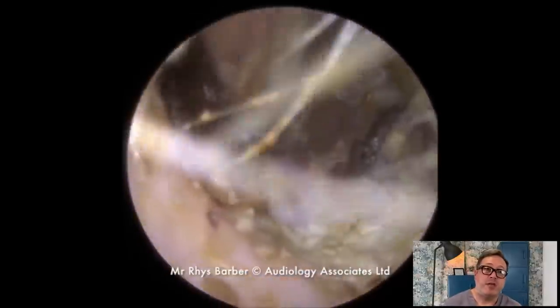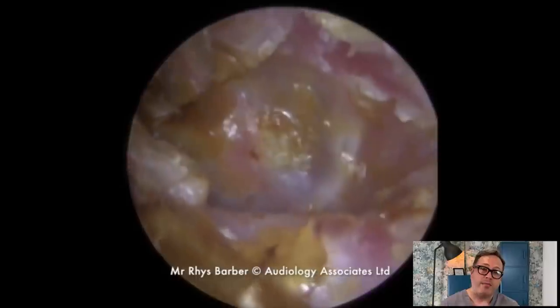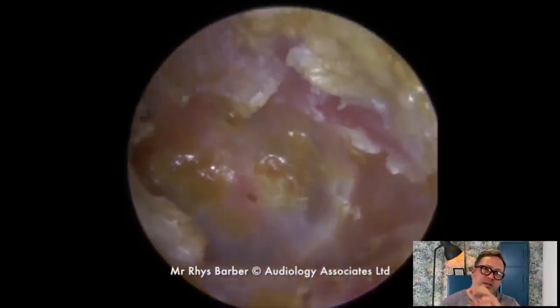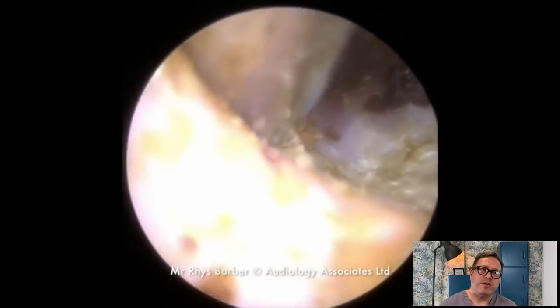Looking at the ear canal when the patient came through for their next suction, we could see the ear canal looked so much healthier — it had repaired itself. The skin was looking far healthier.